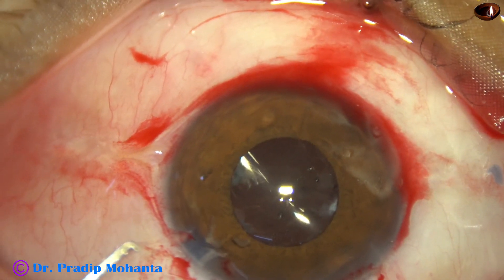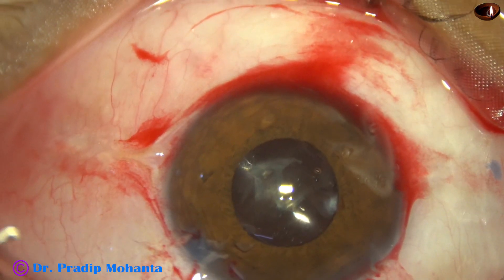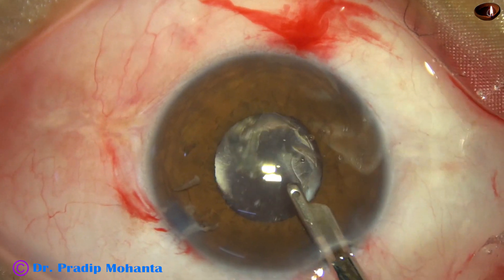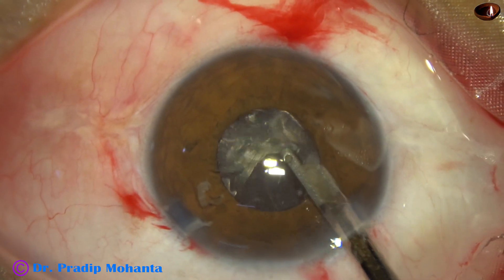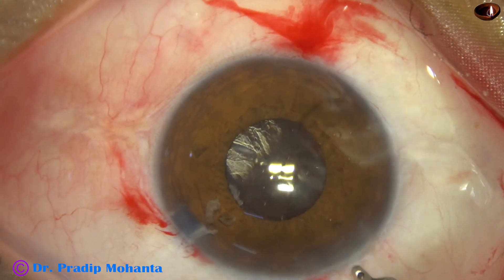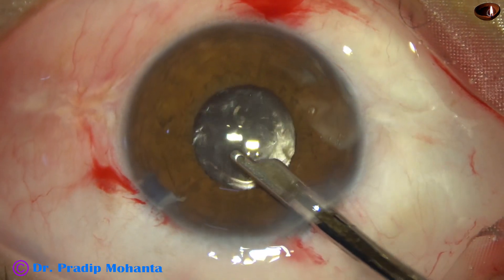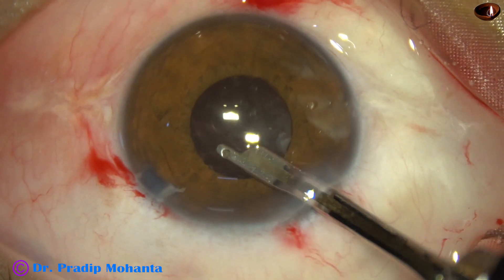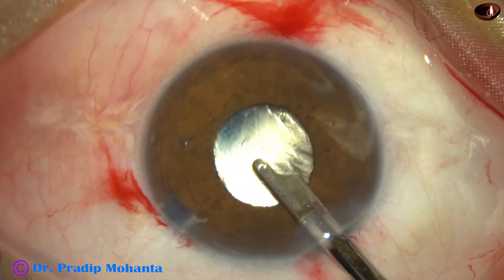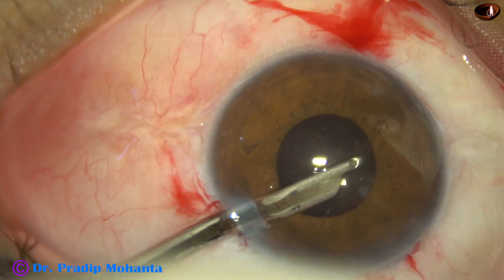And now we have to remove the remaining lens matter. This is a bit of epinucleus and there are some bits and pieces near the side port — some of these bits are pieces of nucleus, small bits of nucleus. These are picked one by one and they are removed. And now I try to go underneath the iris and blindly aspirate some lens matter.